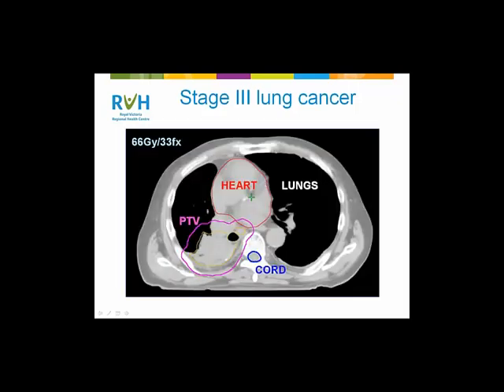Okay, so here's an axial section from a typical patient. We've got the GTV contoured here in orange, and there are also some involved lymph nodes here as well. There may or may not be a CTV depending on your protocol. And finally, we're going to have a PTV that's going to include all of the motion of the target as well as our daily setup uncertainties. Now, depending on regimen, these patients will typically receive a radical dose of anywhere from 60 to, you know, the low 70s of gray with a conventional 2 gray dose per fraction. We're using 66 in 33 in our center.